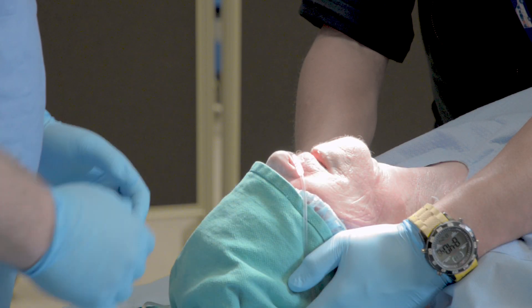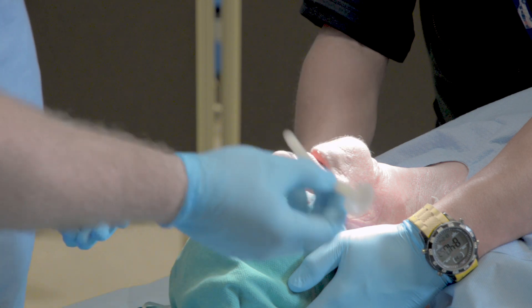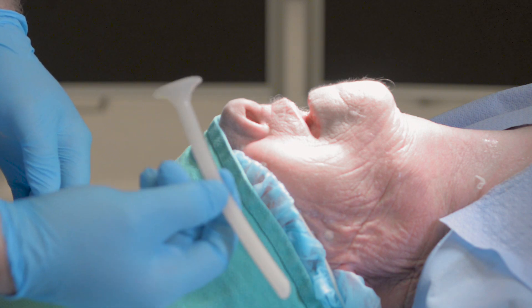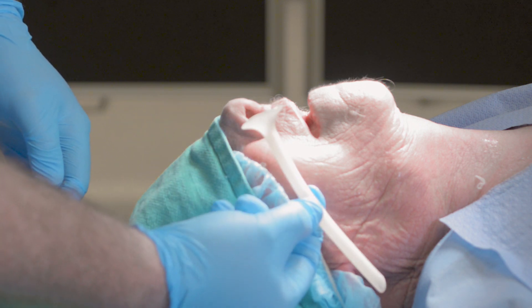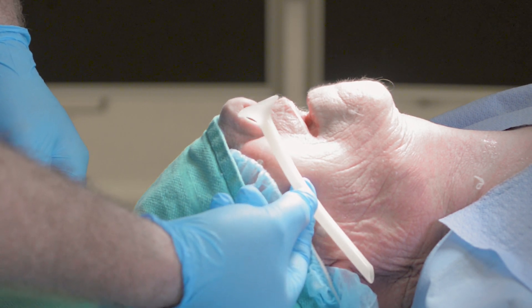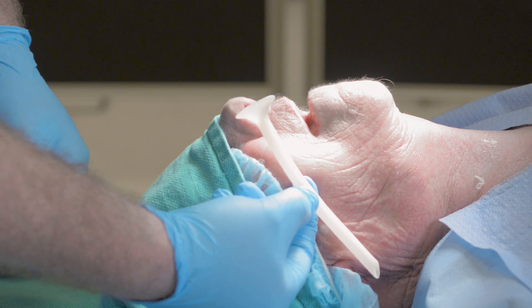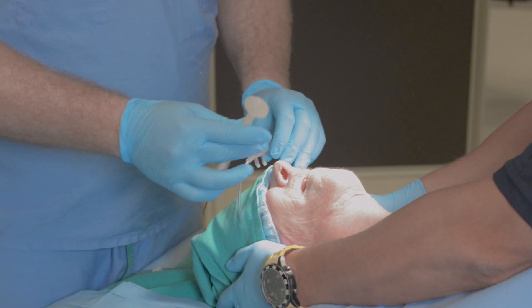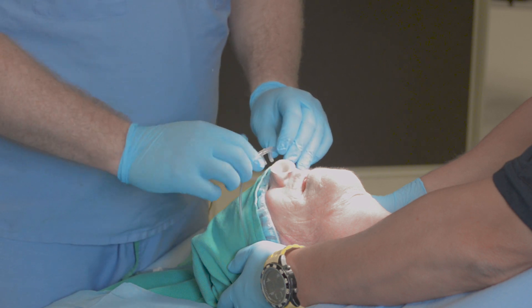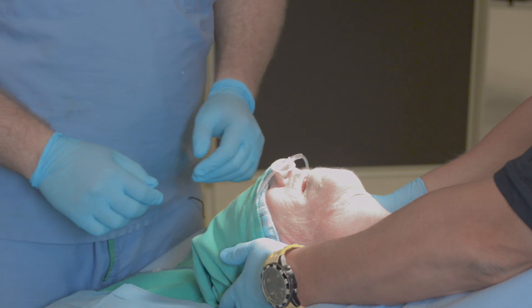We begin by dealing with soft tissue obstruction using a nasal pharyngeal airway. Sizing for a nasal pharyngeal airway is done by holding it up to the side of the patient's face from the patient's nostril to the ear or to the angle of the mandible to appropriately size for the patient. One or more are placed directly into the patient with high-flow nasal prongs directed down through the nasal trumpet.